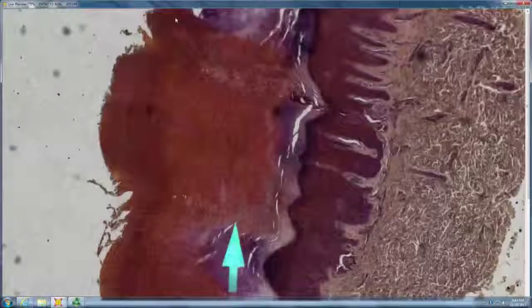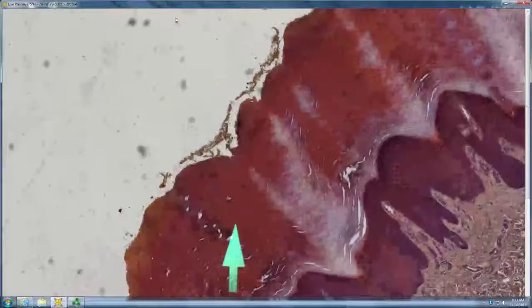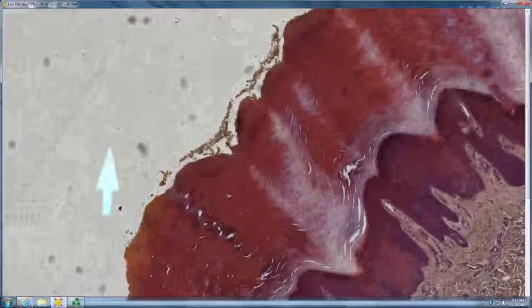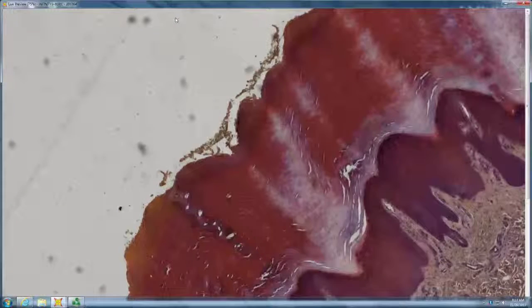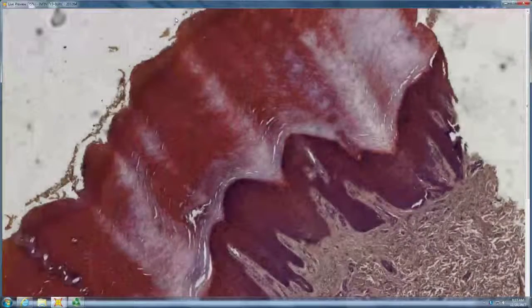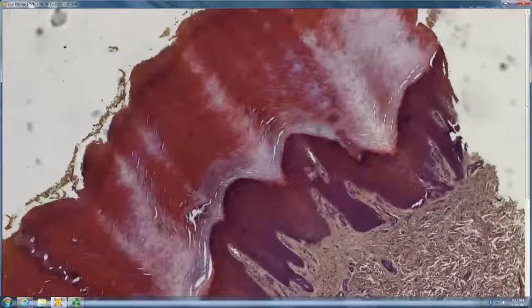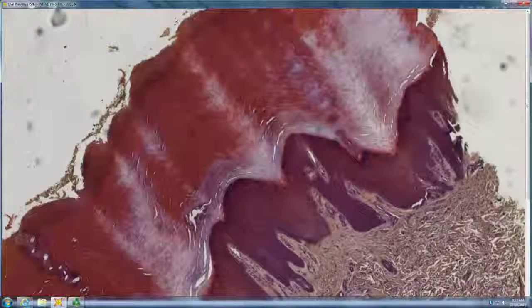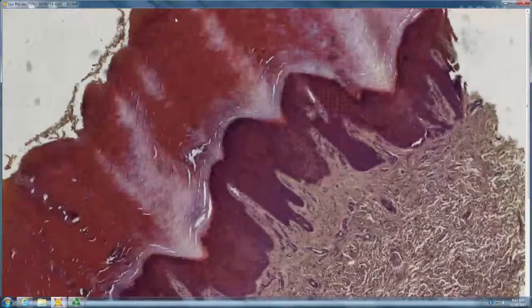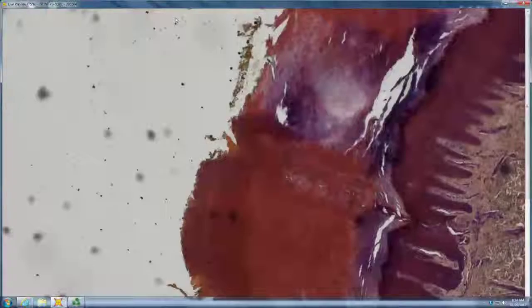Well, we have a lot of compact orthohyperkeratosis. And where do you think you are? Acrally. Yeah, probably volar. Acral just means distal. Right. Volar means palmar, yeah. Sole. Definitely volar. And this could be, it's a little thick even for a palm, right?